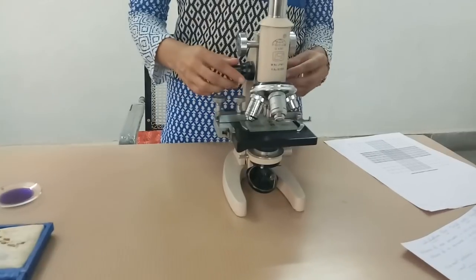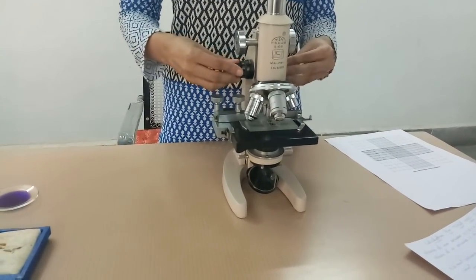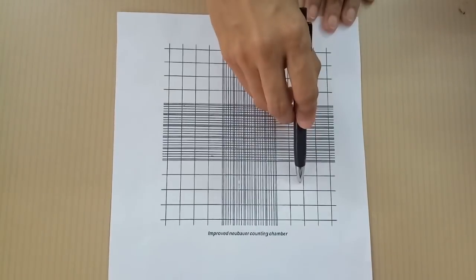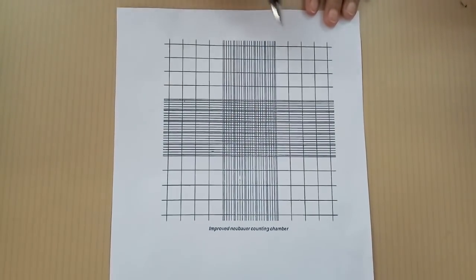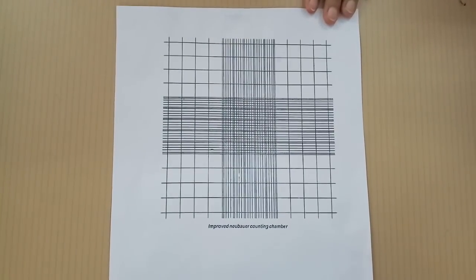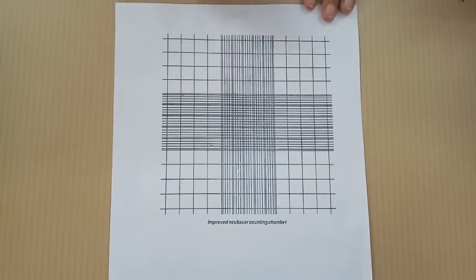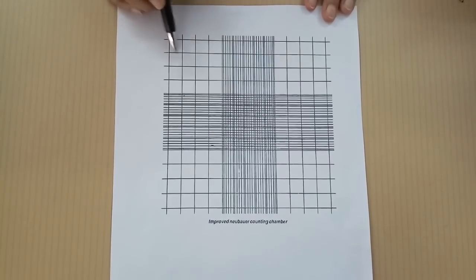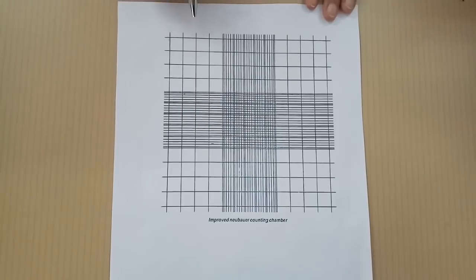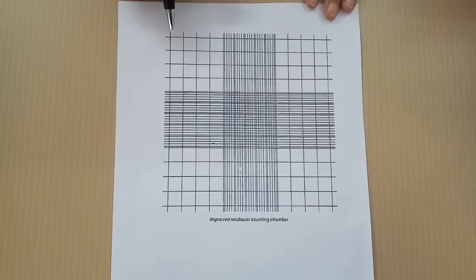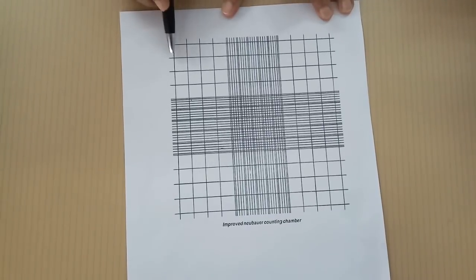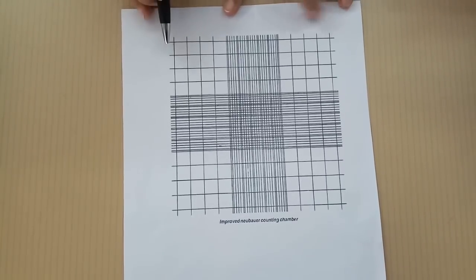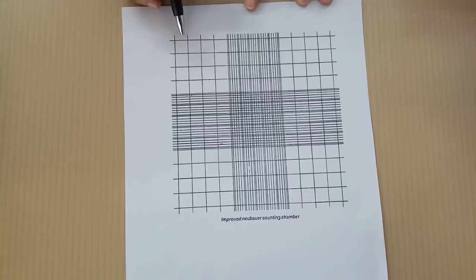Use fine adjustment again and try to identify WBCs. Counting the cells: count the cells in 4 groups of 16 squares each, total 64 squares. We are counting in low power. So this is the view of improved Neubauer chamber in low power. To avoid counting the same cells again, follow the rule of counting using L pattern counting. Count the WBCs present in the square and those on its left and lower line. You can see here inside the square and in the left and lower line, and ignore the WBCs present on right and upper line.